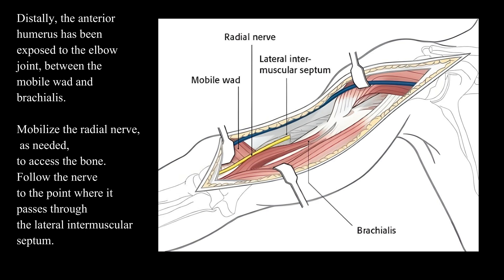Distally, the anterior humerus has been exposed to the elbow joint between the mobile wad and brachialis. Mobilize the radial nerve, as needed, to access the bone. Follow the nerve to the point where it passes through the lateral intermuscular septum.